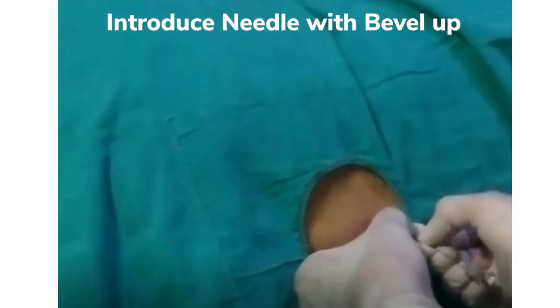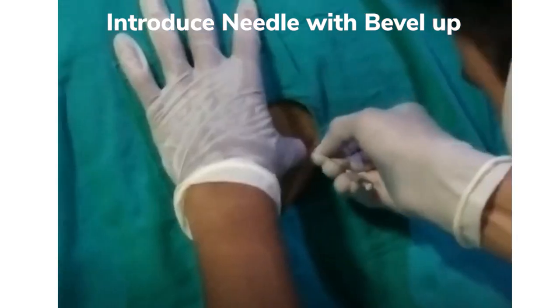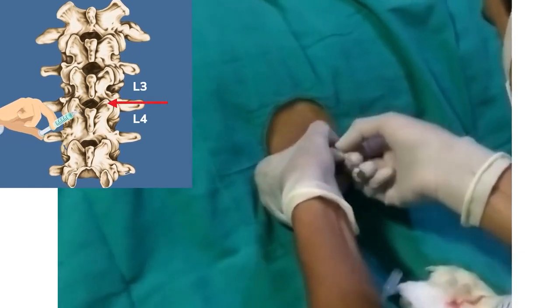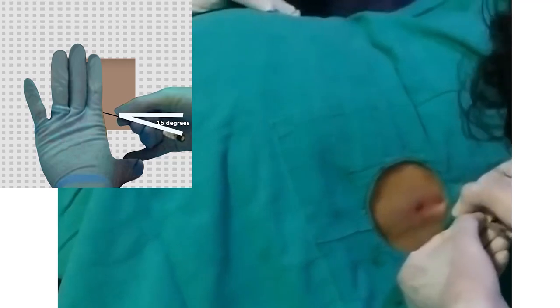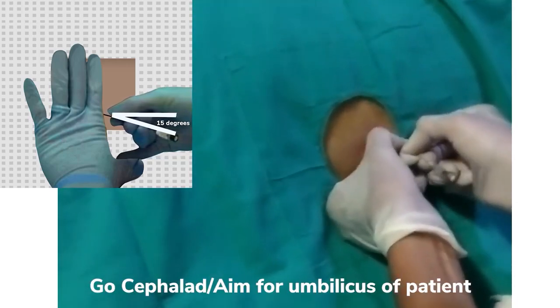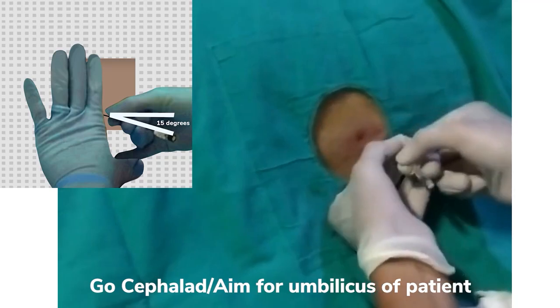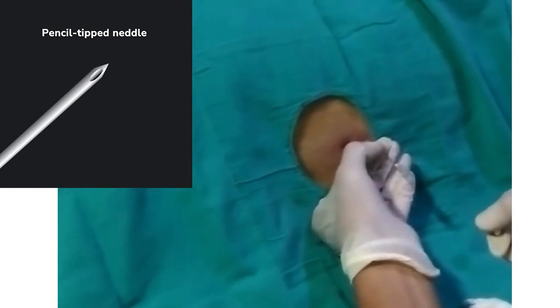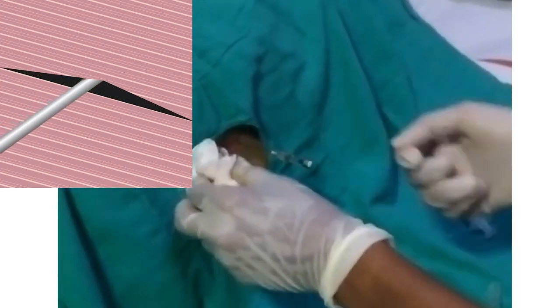Stabilize the 22G needle with your index finger, orient the bevel up. The objective is to separate the longitudinal dura fibers rather than cutting them. The insertion of the needle has to be slightly cephalad and directed towards the umbilicus. The characteristic pop sensation may or may not be heard. The stylet is withdrawn after a depth of about 4 to 5 cm and observed for fluid return.